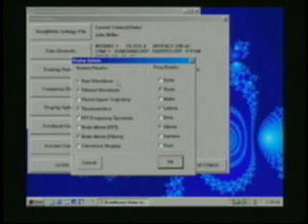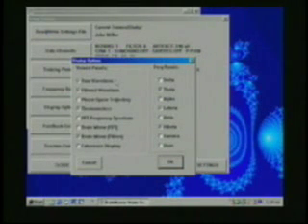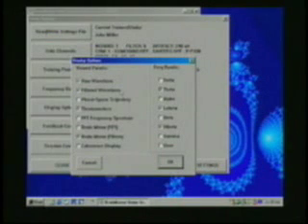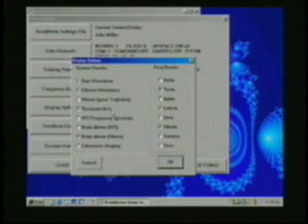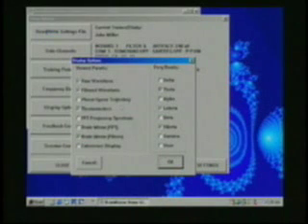For a typical protocol like we're using, we would want to see the raw waveform, which is the EEG, the filtered waveform. The thermometer boxes, which are actually bar graph displays. And the brain mirror. Here it says using filters.